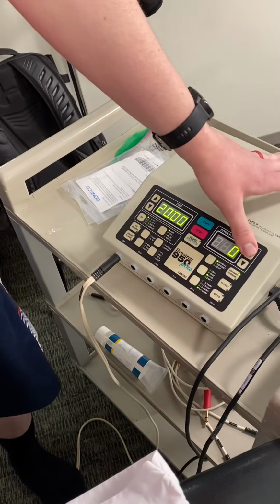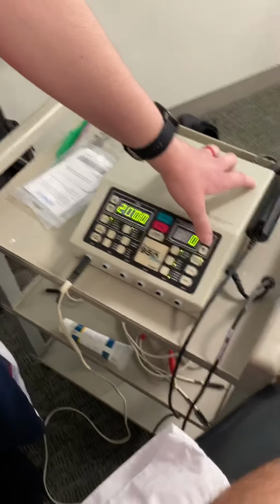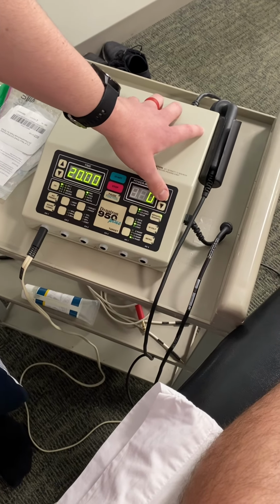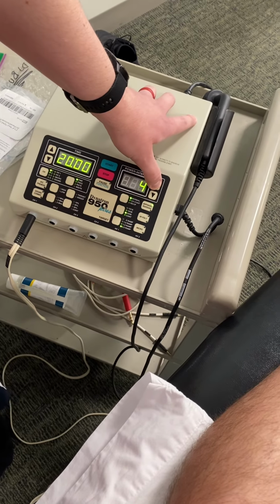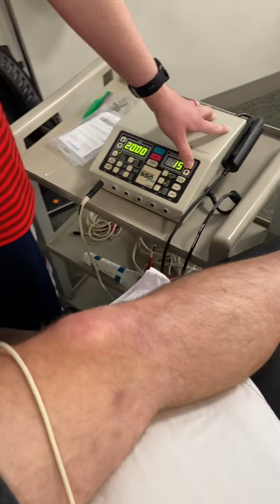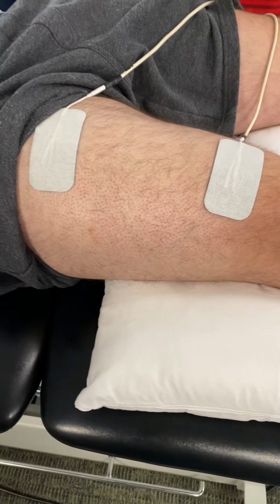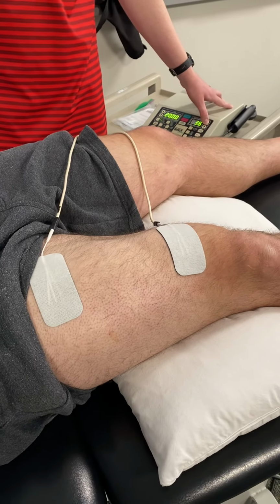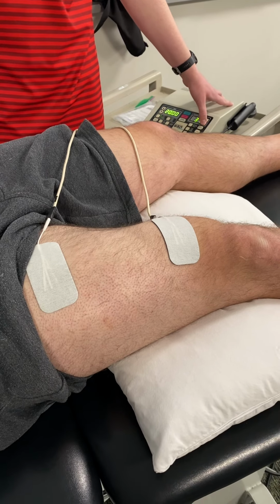So I'm going to go ahead and start turning it up. I'm going to ask the patient when he feels the sensation of the electrical stimulation, and then I'm going to go until he has a strong muscle contraction, and I'm going to try and go pretty quickly so that his body doesn't adapt to the E-stim. So go ahead and tell me. Sensation. Starting to feel it. Yep. Okay, getting good. You want to go down a little bit?